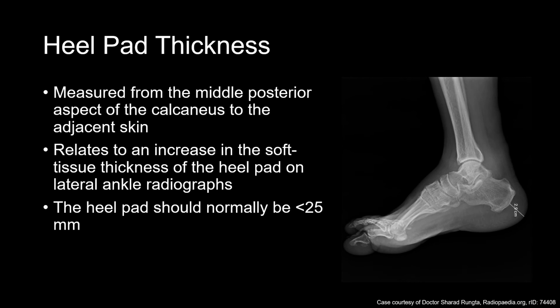If it's larger, it may indicate the presence of a pituitary adenoma within the individual.